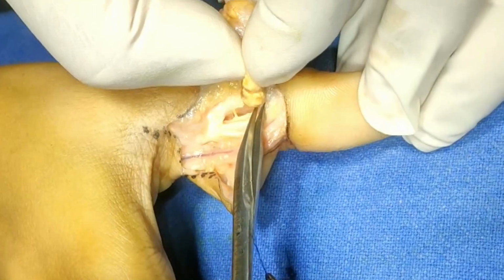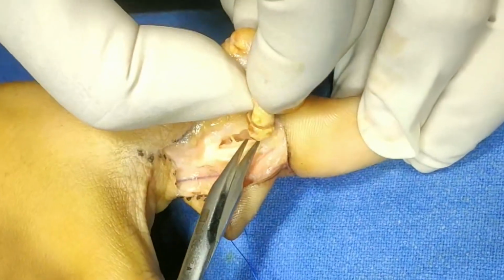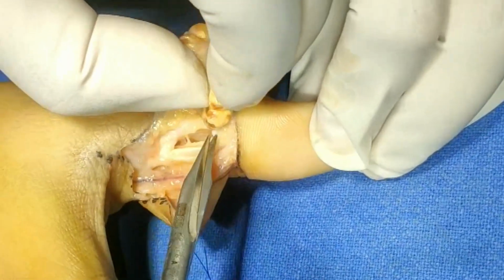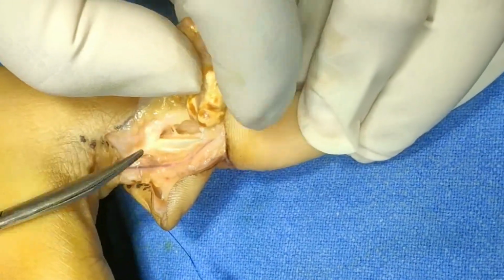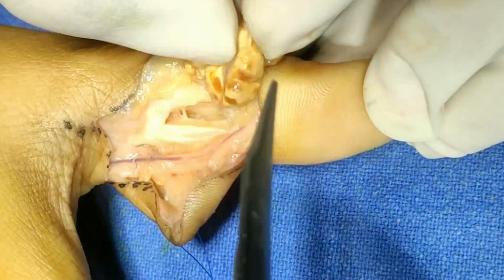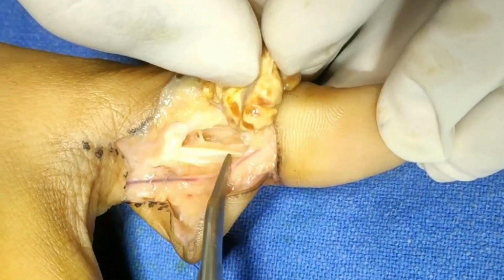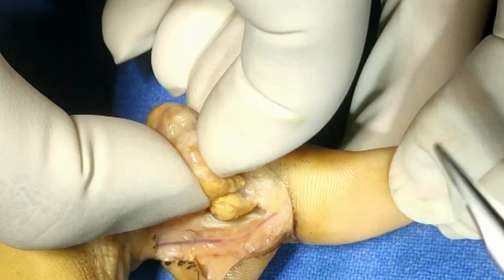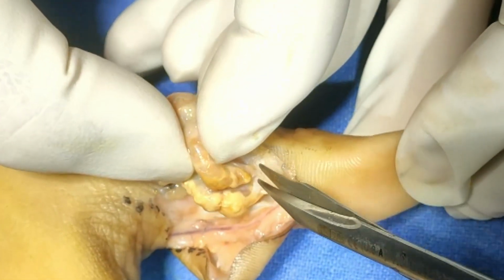Nothing, because I have separated out the tissue here. Just maybe cutting it. Yes. Now, this is the bone here. This is the tendon. This is the neurovascular bundle. This is adherent to the capsule also, of the joint.